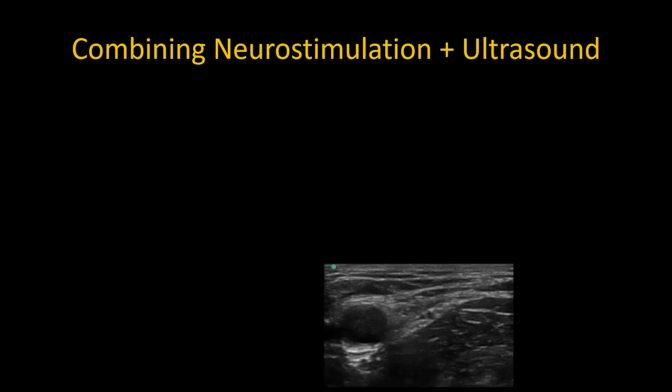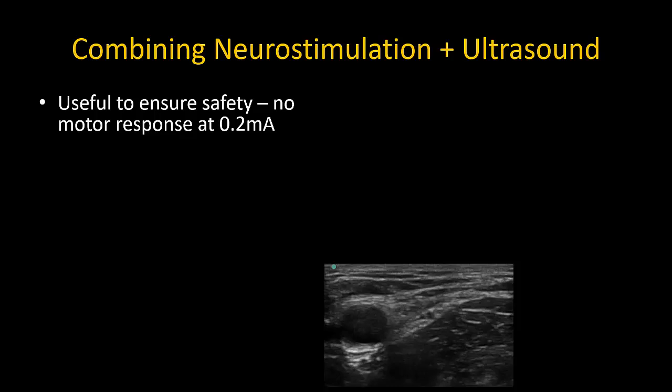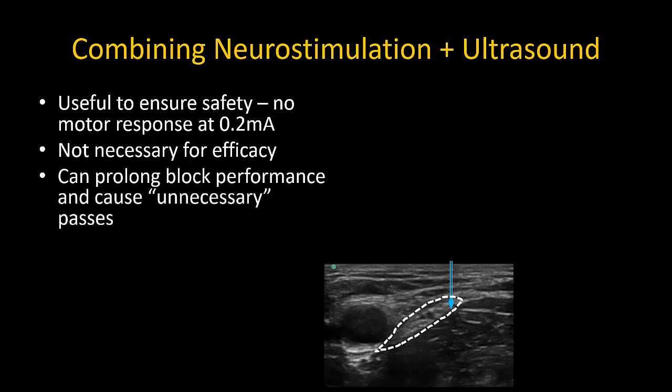I'll end with a comment on neurostimulation. I personally do not routinely use it with ultrasound guidance, but it is a helpful adjunct primarily to avoid intraneural needle placement. With the current set at 0.2 mA, there should be no motor responses seen when the needle tip is within the fascia iliaca compartment next to the nerve. If the nerve can be visualized, as is usually the case, neurostimulation is not necessary for efficacy and may only serve to prolong block performance or lead to unnecessary needle passes. The key to a successful block, as always, is visualizing spread around the nerve in its sheath.